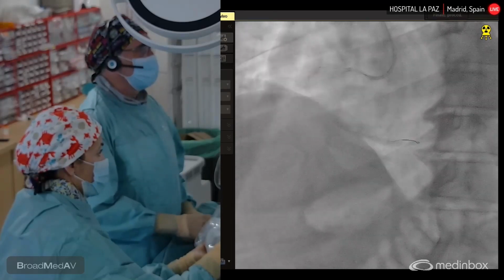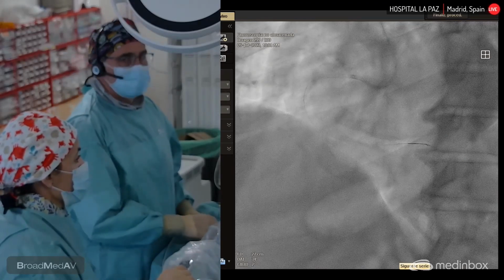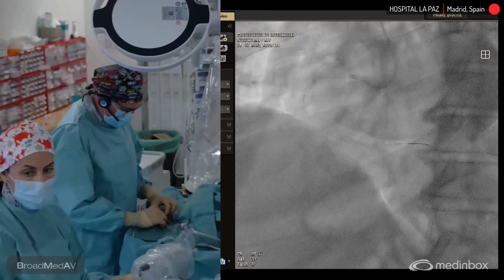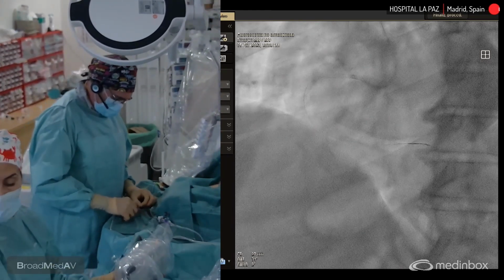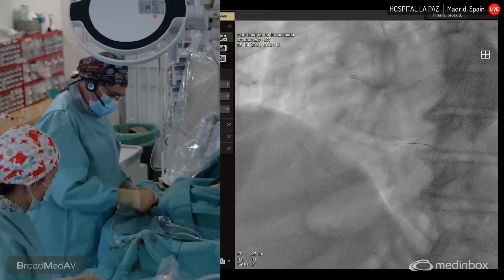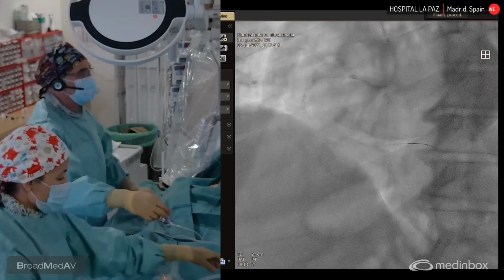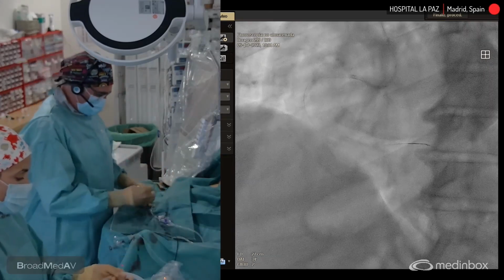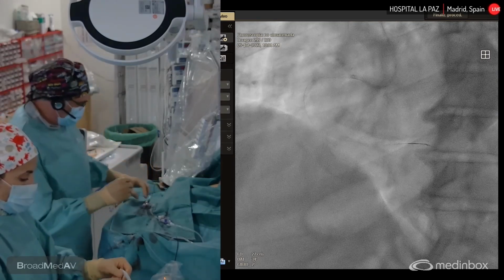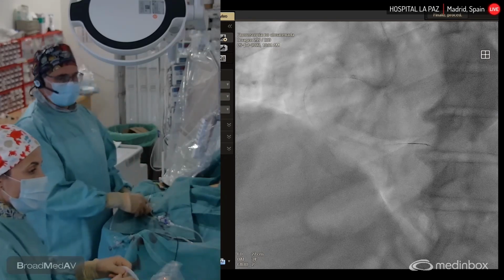So, give me please a 2.5 balloon. 2.5 balloon. 2.5, un 15 o así, Isabel.